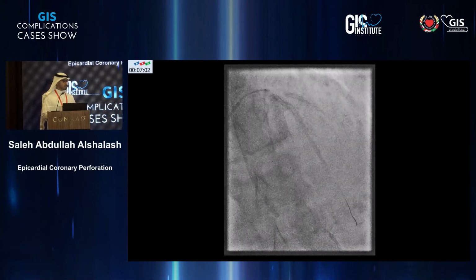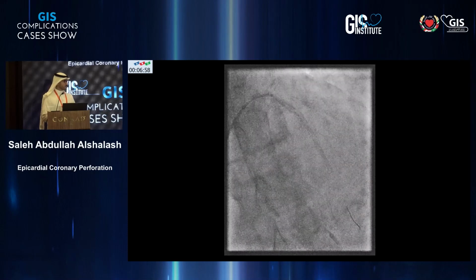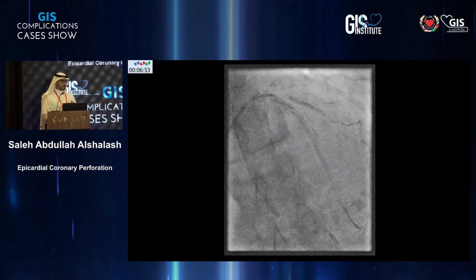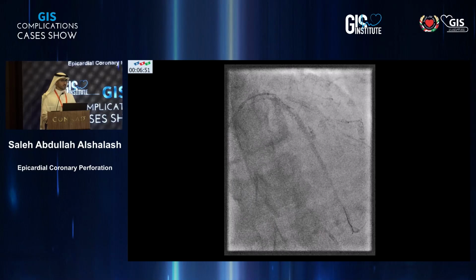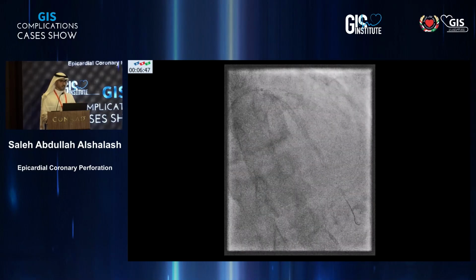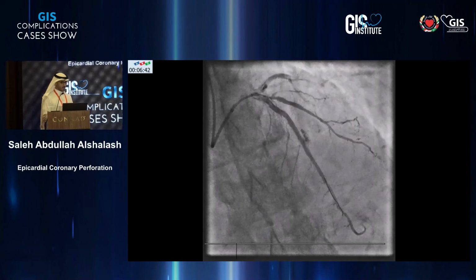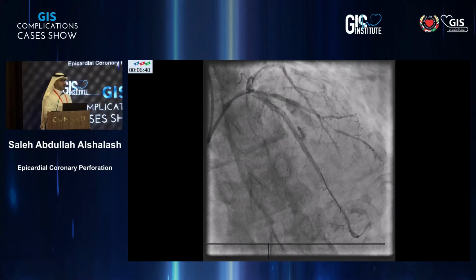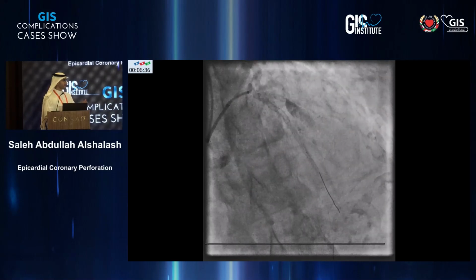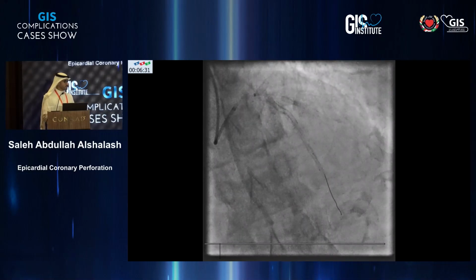Echo comes in, hemodynamics are just great. We do an echo and there is just no effusion, nil, none whatsoever. Now the balloon is up at the site of the perforation. I thought, okay, let's just keep it up for 10 minutes. Maybe it will seal and maybe we'll have just nothing. So after 10 minutes, this is the angiogram. I say, okay, maybe we were really good. We sealed the perforation so fast that there was no effusion collected.